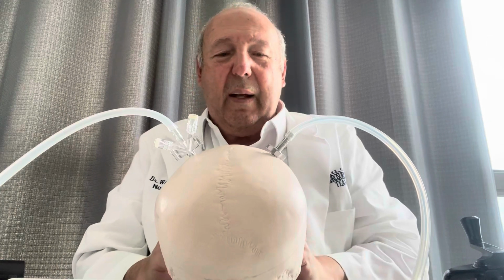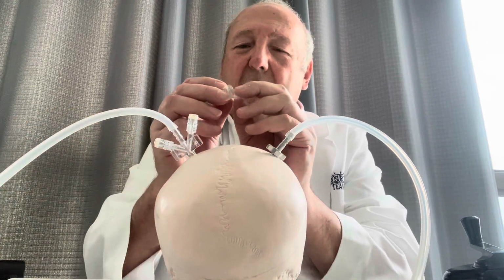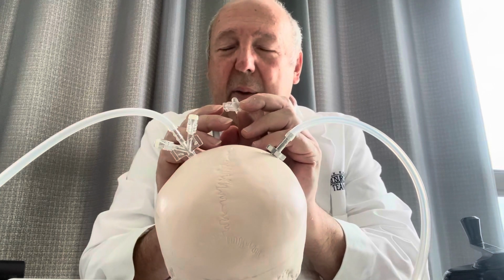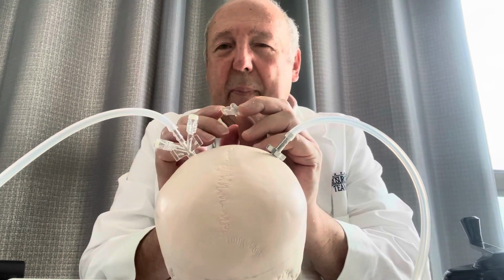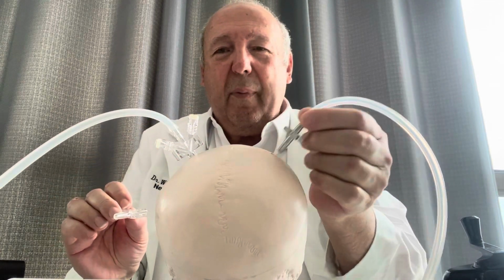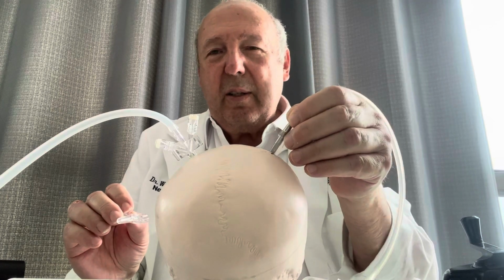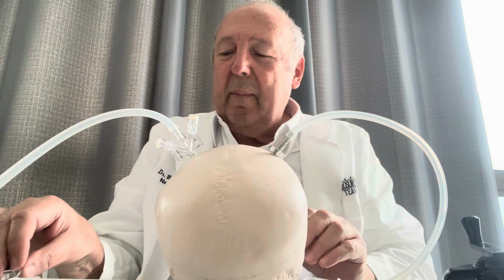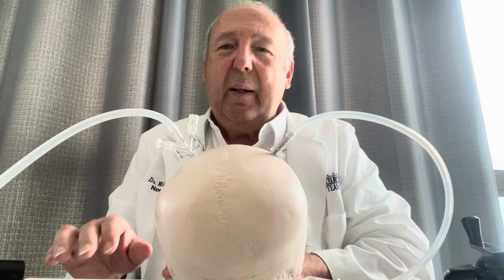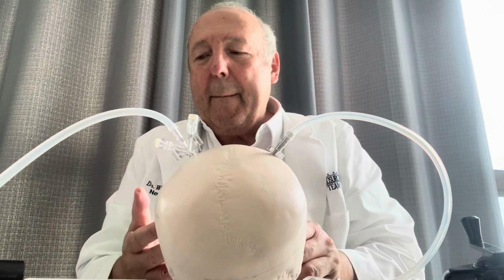Another feature that's very important, the inner diameter of the NASP measures approximately 4 millimeters, while the inner diameter of the SEPS measures approximately 3 millimeters. The wider the lumen, the less the chance of it plugging up.